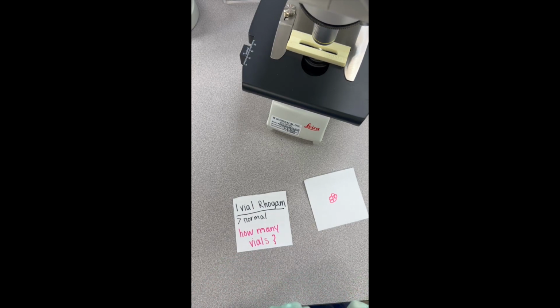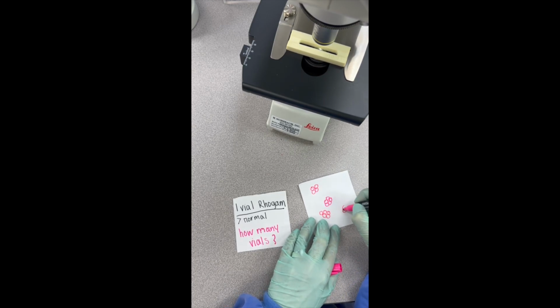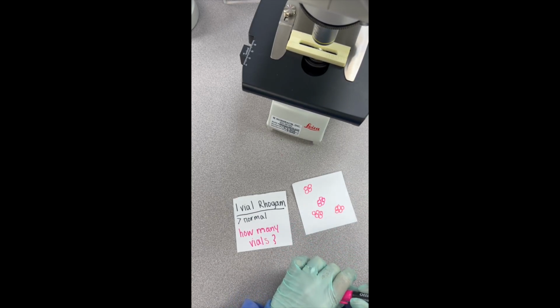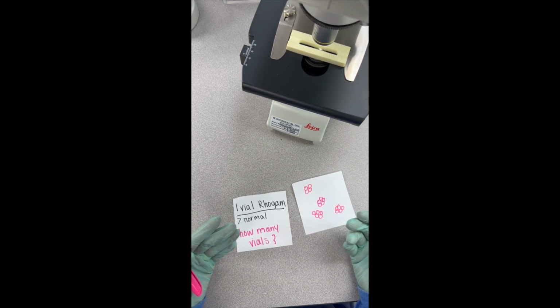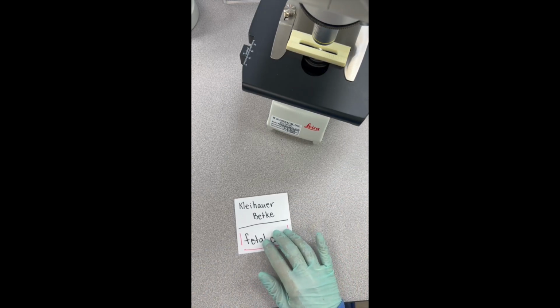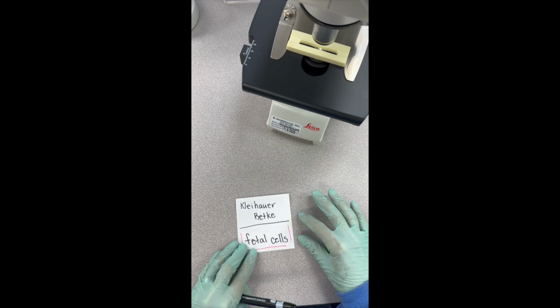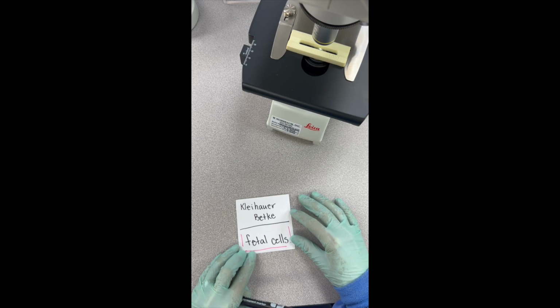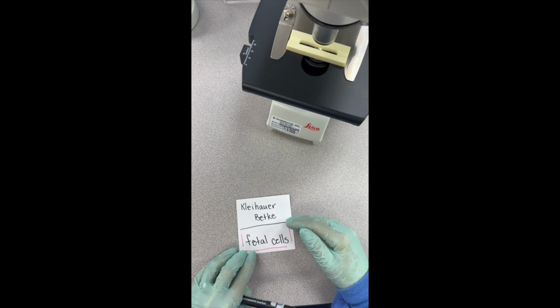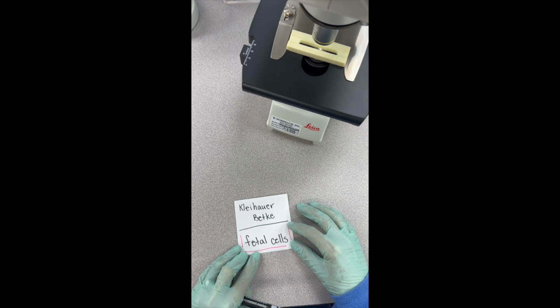Now the problem arises if we see more than 5 of these rosettes under the microscope in this fetal screen. We have to do something more. We have to quantitate how much of the baby's blood got into the mom's bloodstream, into her circulation. And in order to determine that, we have to do a Kleihauer-Betke. That Kleihauer-Betke is where we make slides and we do a special stain on that. And I'm going to have another video going over that with you guys. But it's important to remember that the Kleihauer-Betke detects specifically fetal cells.